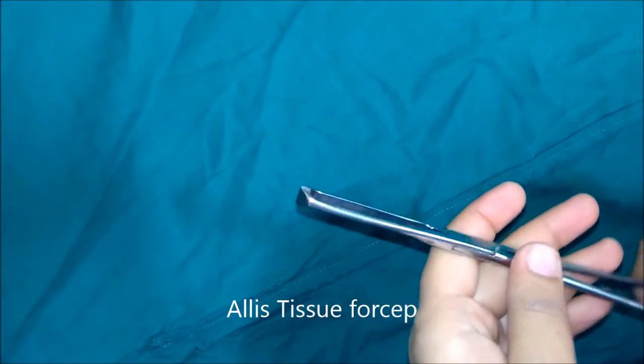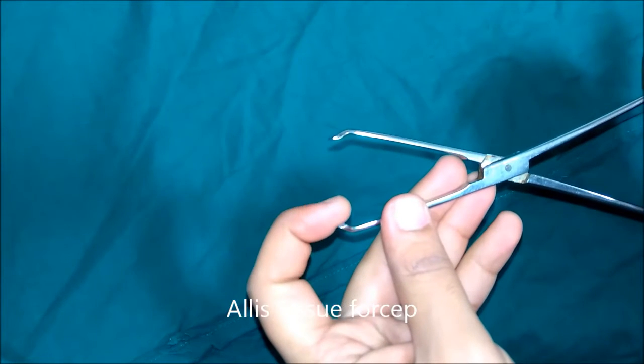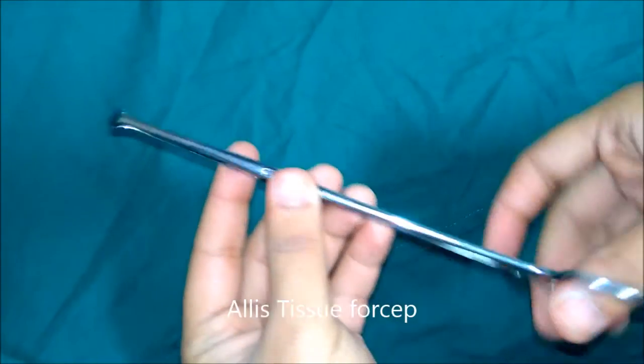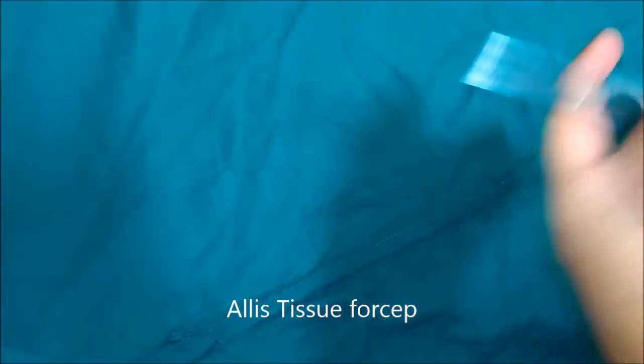This is Allis tissue forceps. The tip of the blades are provided with sharp teeth with grooves in between. After closing the blades there is a gap in between which can accommodate some amount of tissue. This is used to hold tough structures like flaps, fascia, aponeurosis, or sheath.